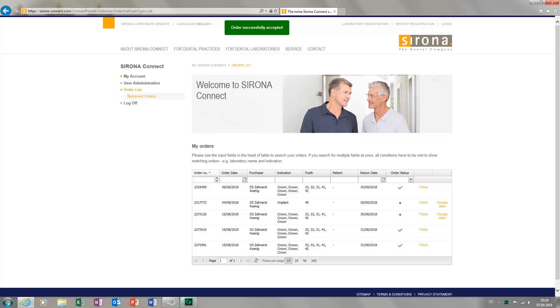Back on the Order List page in the portal, we receive a confirmation at the top of the screen, marked in green, to let us know that the order is successfully accepted.